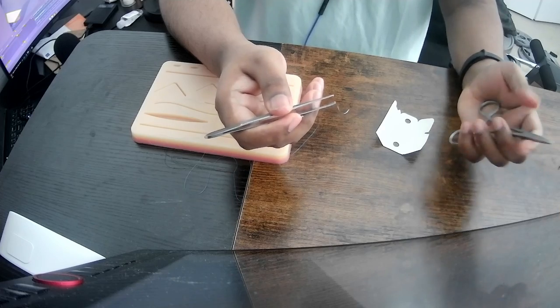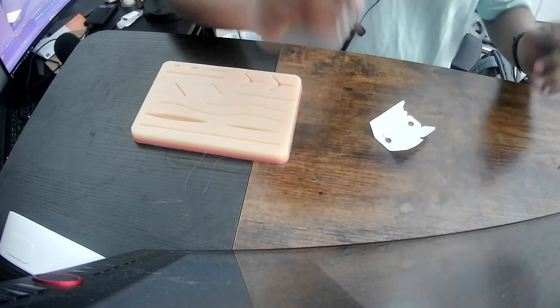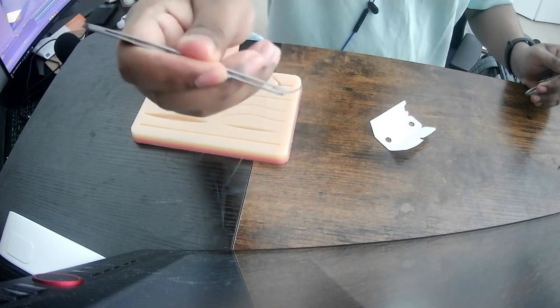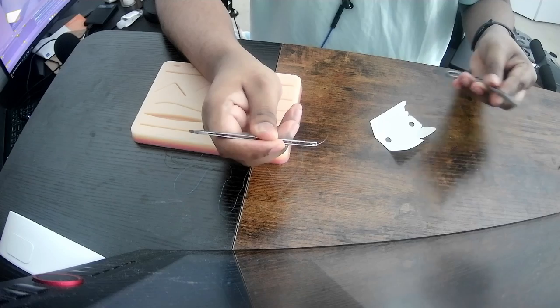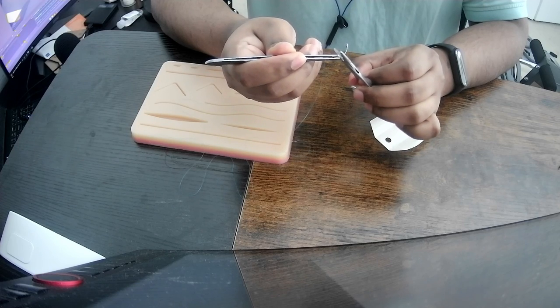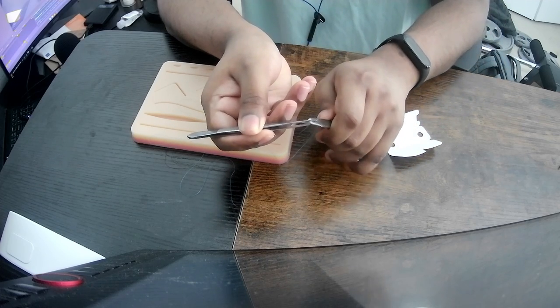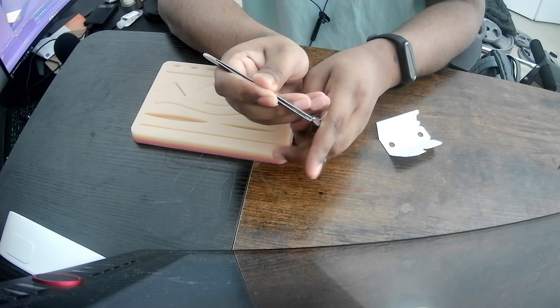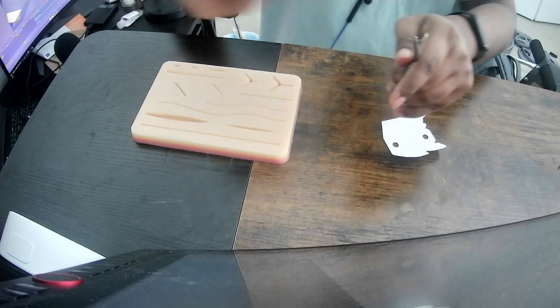Left hand feels a little harder because I'm pushing with my weaker fingers. Okay, let's do the loading part again, firm and secure. Okay, left hand. Needle driver unlocked. Let's load it about here. Halfway maybe. One third. Okay, and then lock it, I guess. Perpendicular. I'm just making the angle right. And then locked. Okay, I can let go now.